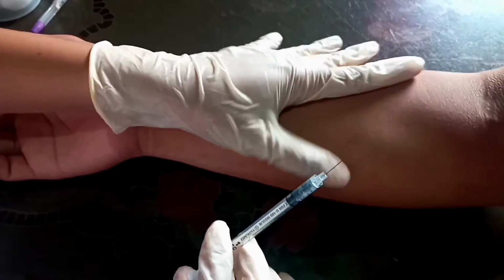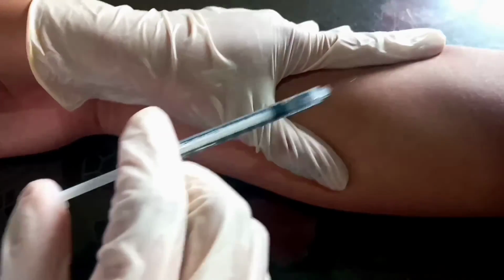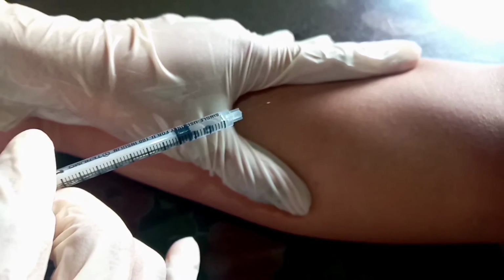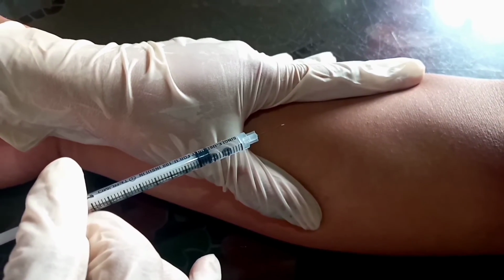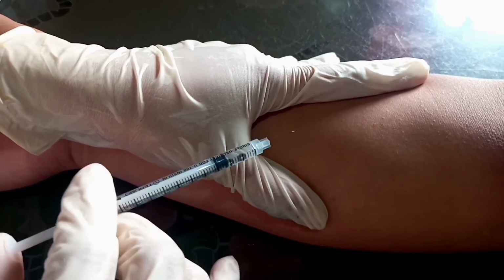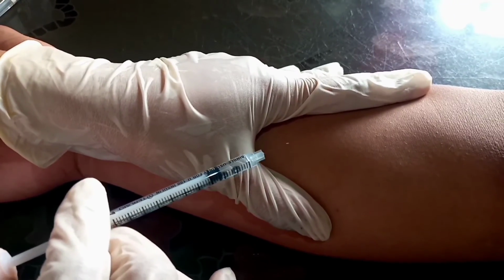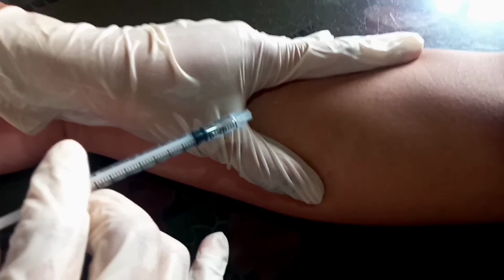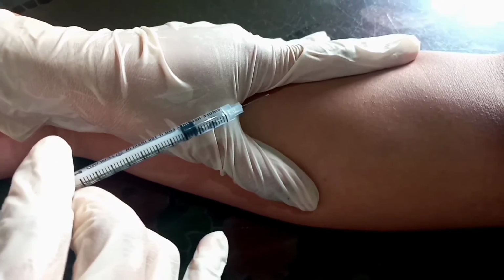Pull and insert. Insert the tip of the needle far enough to place the bevel through the epidermis to the dermis. We need to stabilize the syringe and the needle and inject the medication carefully and slowly so that it produces a small wheal on the skin.